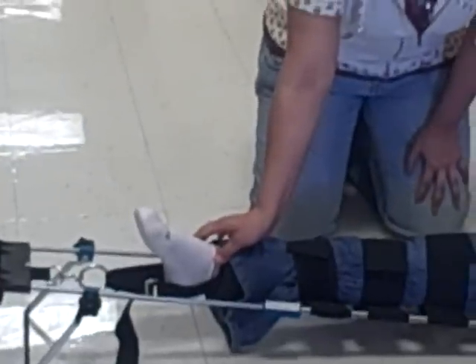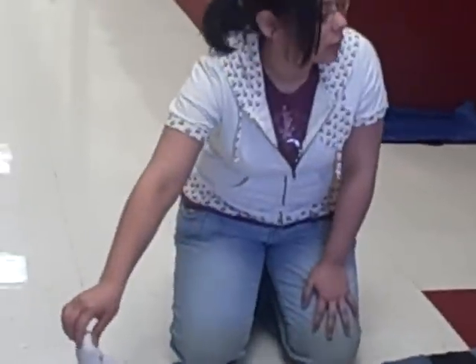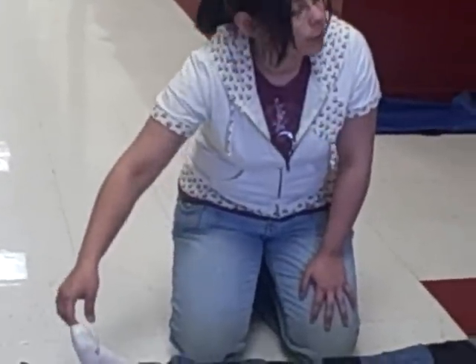I will check for PMS again. Do I have a pulse? Pulse is present. Can you wiggle your toes? Which toe am I touching? Can you feel two toes?